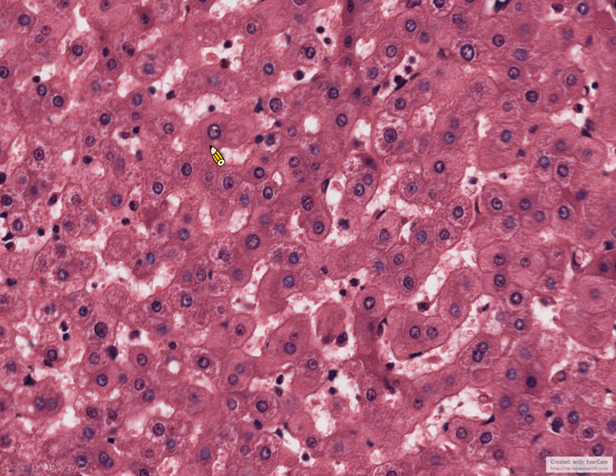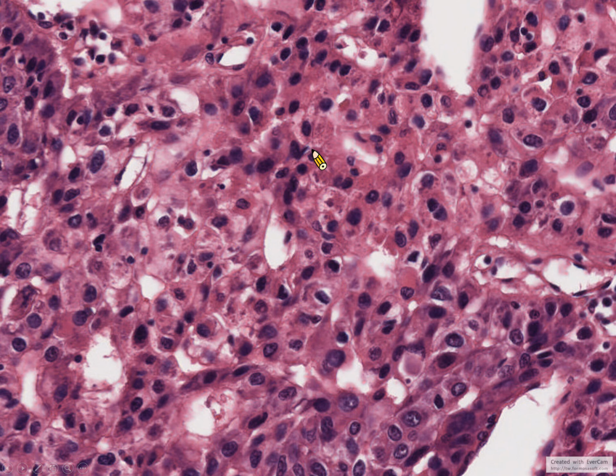Okay, so you can see that in this one, it has still kind of regular cell arrangement, but in this one, the arrangement seems to be more random, and you can also see that the nucleus part is more dark, which means that it has heavy activity in DNA replication, and there is a lot of chromosome, so you can see darker colors from the stain.